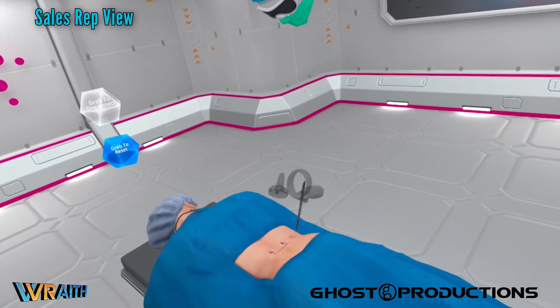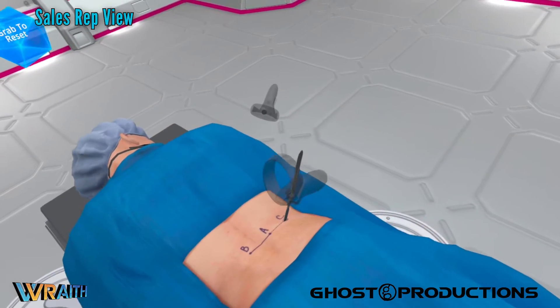So it's just a stab dissection? Mm-hmm. Looks good.